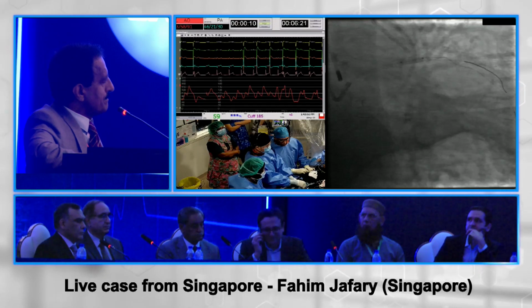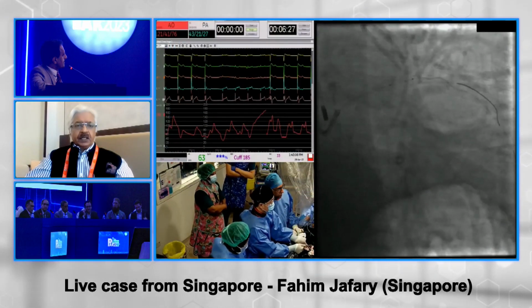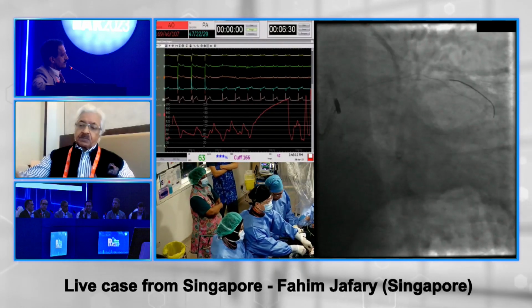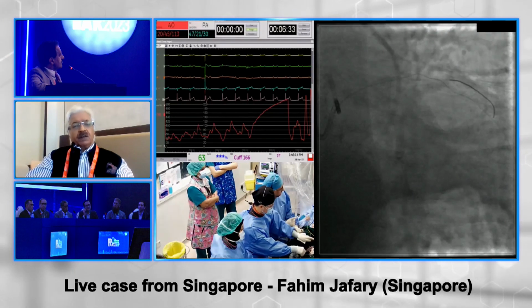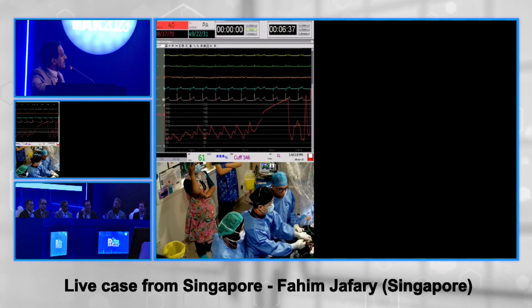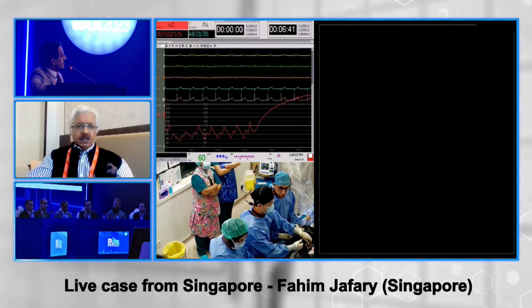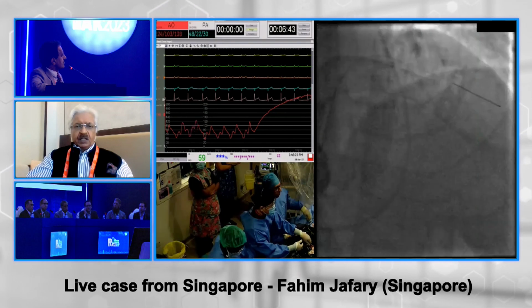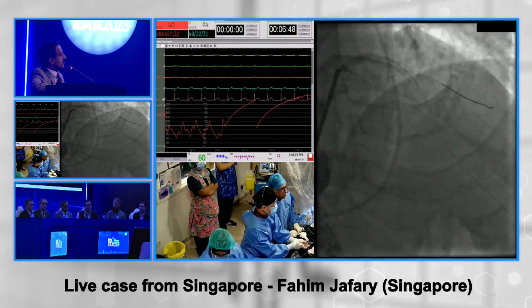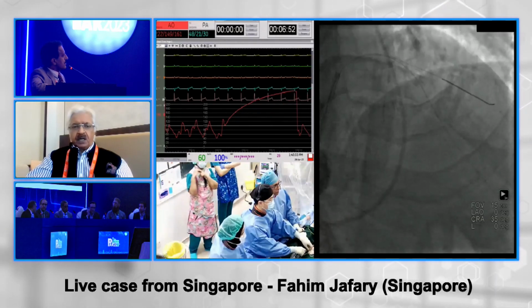No, I've used all, you're right, but clearly the preference is for Wolverine. I think it's a very trackable balloon now, and of course it makes much better sense. If you really have to use a device, it has to be effective, and with those blades, Wolverine is the most effective cutting balloon available. So I think it's fair to use a device which is logically very effective as well. There's no randomized comparison between the two.